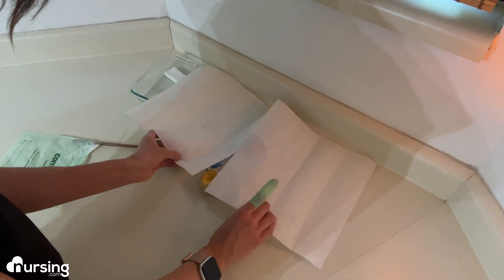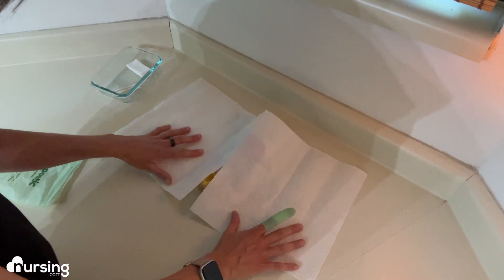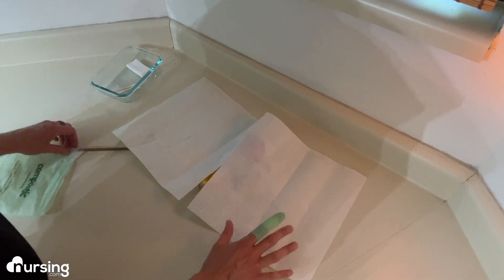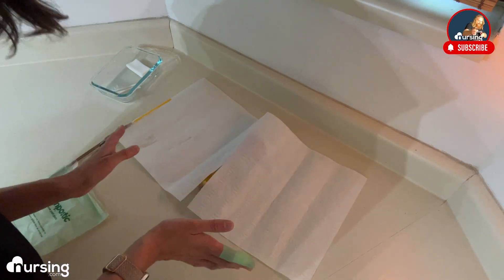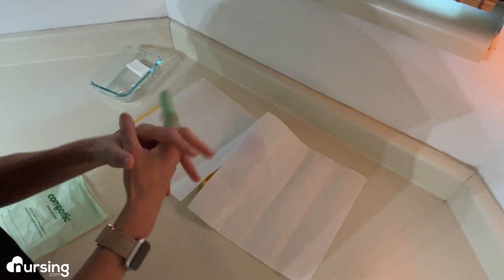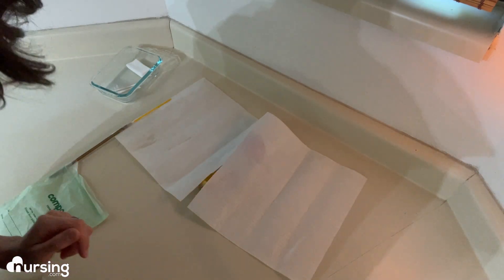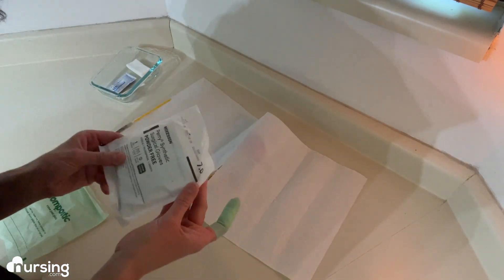So I will set up my patient with the fenestrated drape, and then make sure that you can do preliminary care with some peri wipes and of course gloves. Then we'll do hand hygiene, make sure that I've got my hands all nice and clean, and then very first and foremost, we're going to apply sterile gloves.